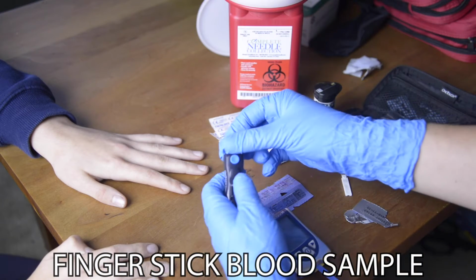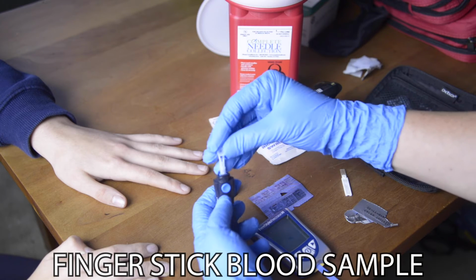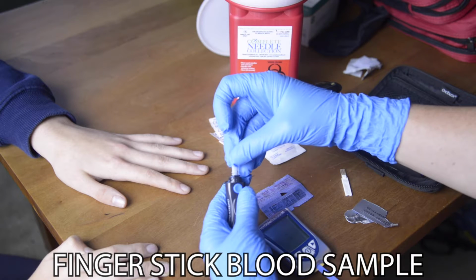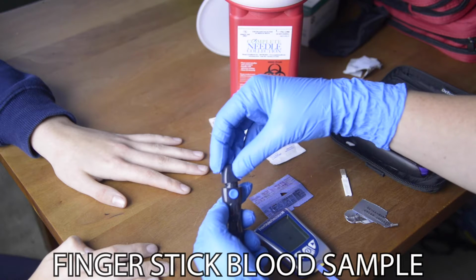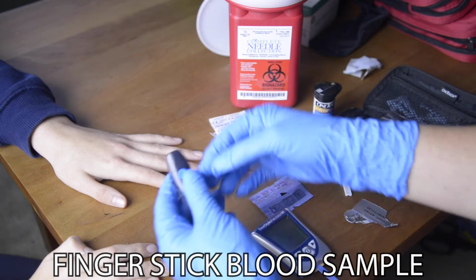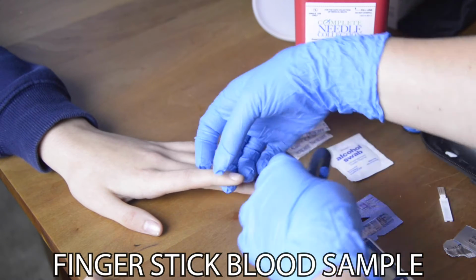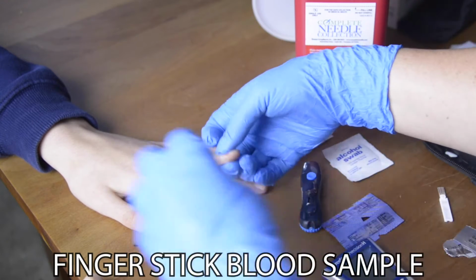The lancet is a spring-loaded device that has a needle inside it that will generally allow us to express a good drop of blood.